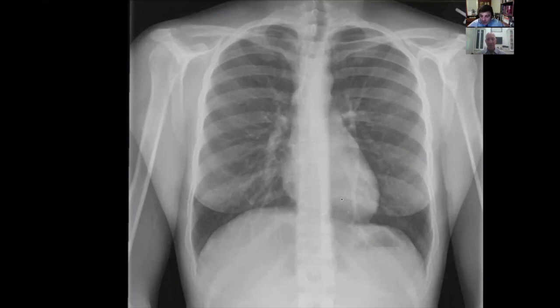When you look at it, with your technique of going through the lung fields first, I see pretty good symmetry there. I'm looking at all the borders, the heart borders and the diaphragmatic borders. That looks pretty good. Looking at the periphery, that looks pretty normal. The vascularity is a little bit prominent, but it's equal, and I don't think I can make anything out about it. No free air. The bones look okay. Maybe the trachea is a little bit deviated, but I don't know what to make of that. This looks pretty normal to me, actually. So I don't know. You stumped me.